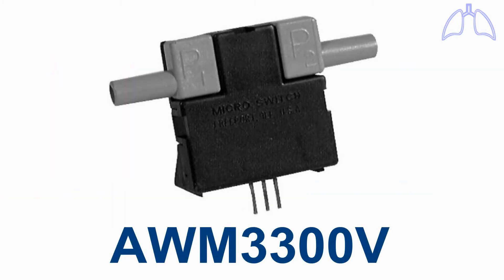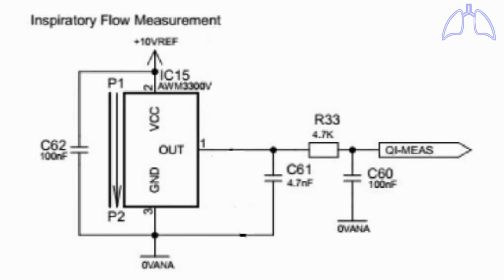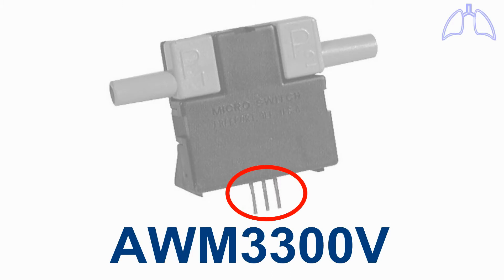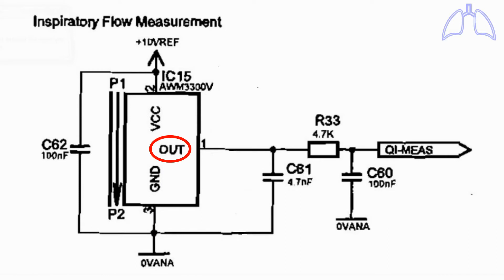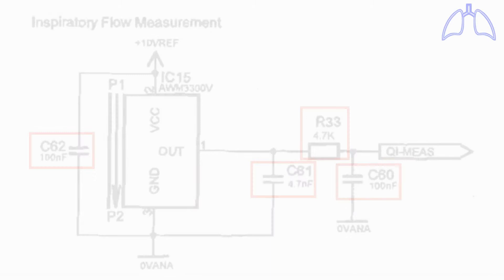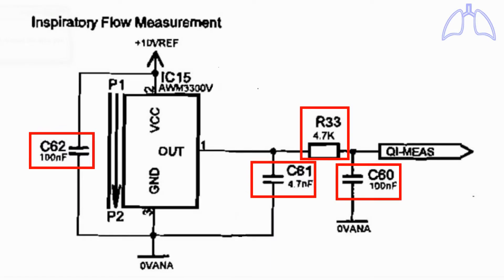In the Medtronic PB560, we use the AWM3300V as a flow sensor. You can download its datasheet from the description of this video. The circuit of the flow sensing is very simple. The flow sensor has three terminals: two of them are connected to the power supply, and the third terminal is the sensor output. The other components of the circuit are simple passive components.